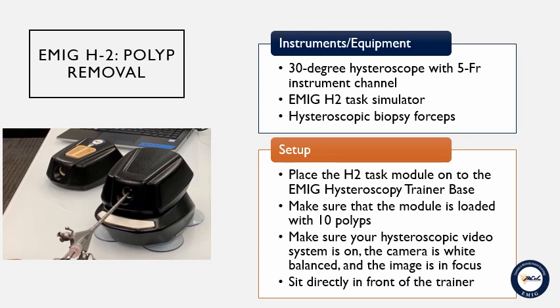To begin, place the H2 task module on the base unit of the Emig hysteroscopy system. Be sure that your video unit and light source are on, the camera is white balanced, and the image is in focus. Seat yourself directly in front of the trainer, making sure to have a clear line of sight to the video display.